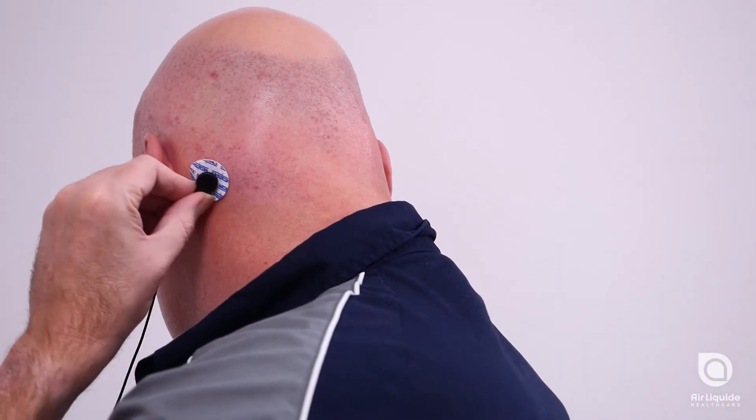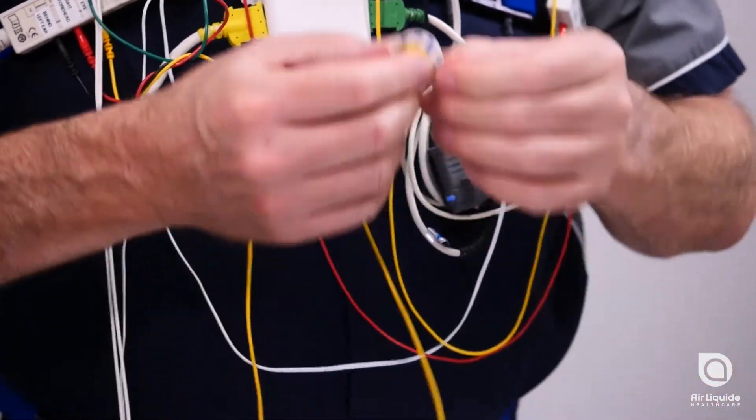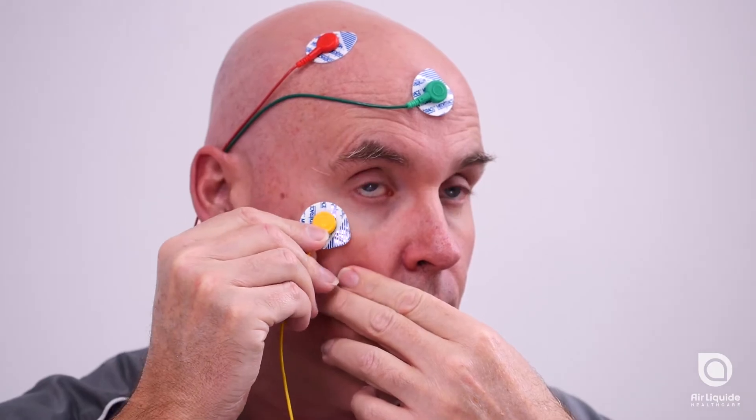Next, attach the lead behind your left ear. Attach the remaining electrode tabs on your face while following the colours shown in your manual. Run the leads over your right ear to keep them out of your face.